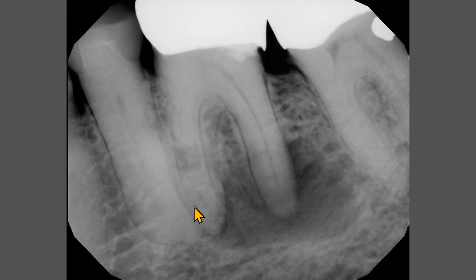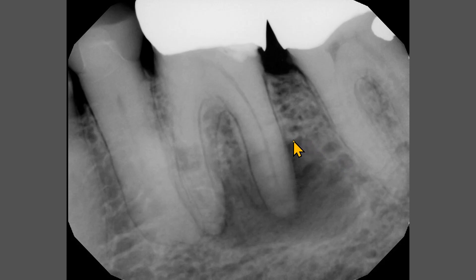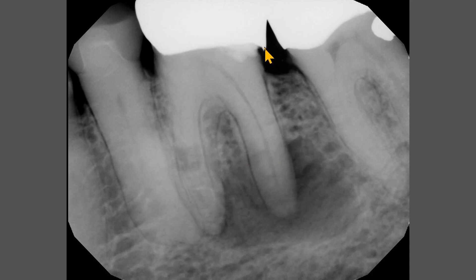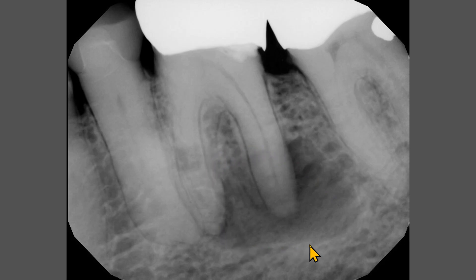There is a radiolucency extending from the mesial root of the first molar almost to the mesial root of the second molar. Superiorly, this radiolucency is at the middle third of the distal root. Because this tooth has a large crown with a defective posterior margin, maybe we can think of a pulpal exposure and consider a radicular cyst.